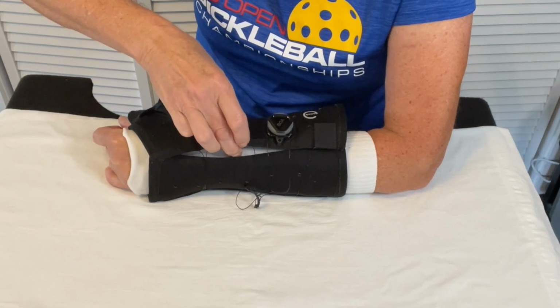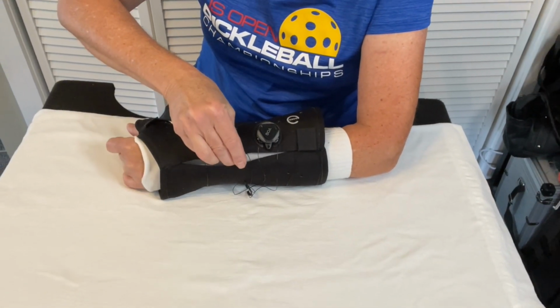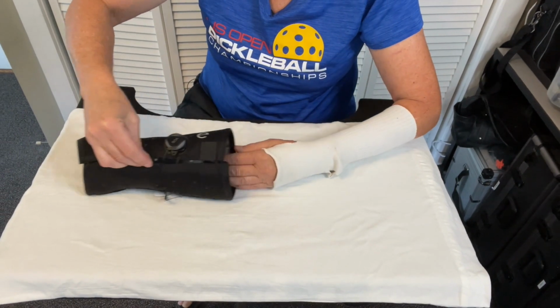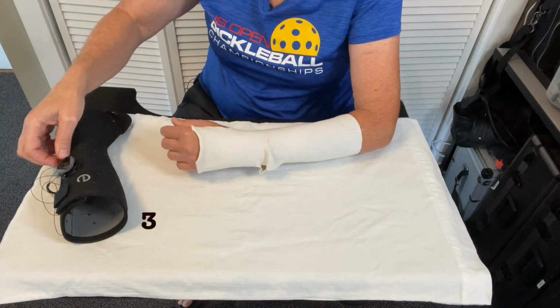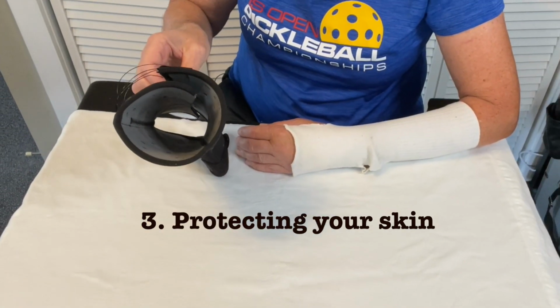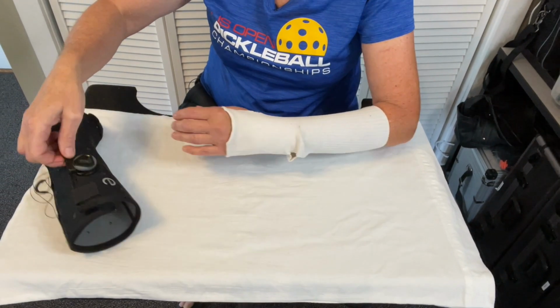So once that's open, I actually put my finger in there to help spread it a little bit more, just for my own comfort, and then I can pull it out. Now you're going to see my add-on here because this particular material can be somewhat irritating over time. Really, the first 4 or 5 days, it was like a miracle. I really enjoyed having that versus a traditional cast.